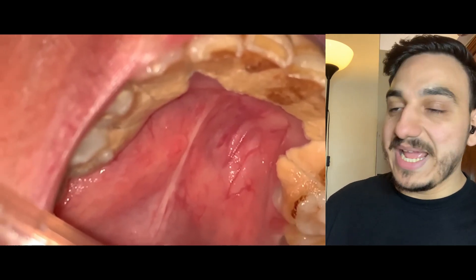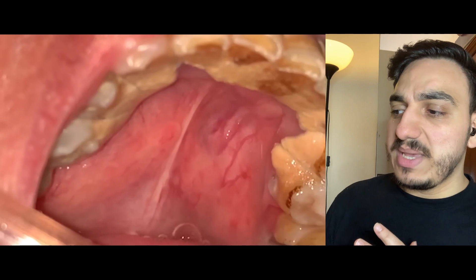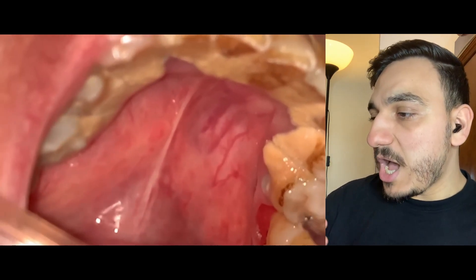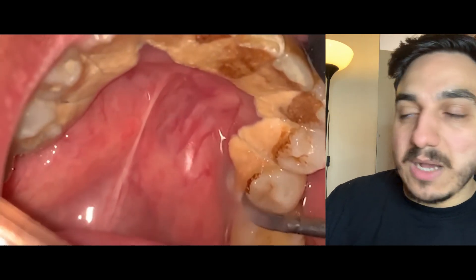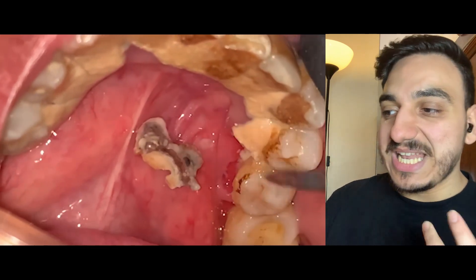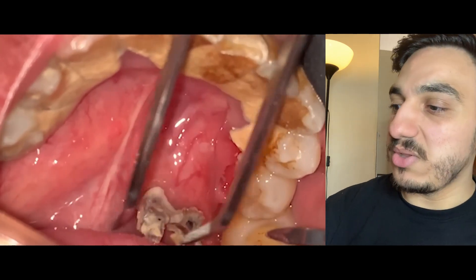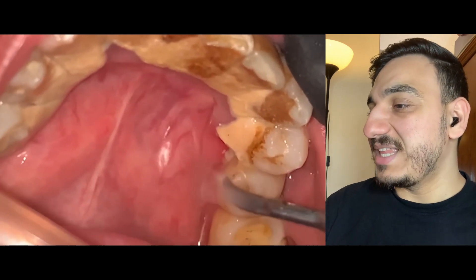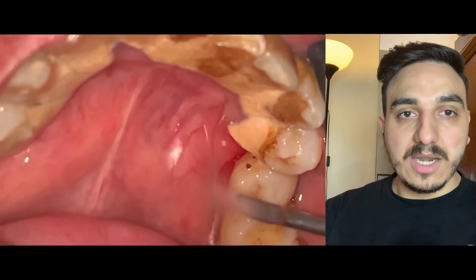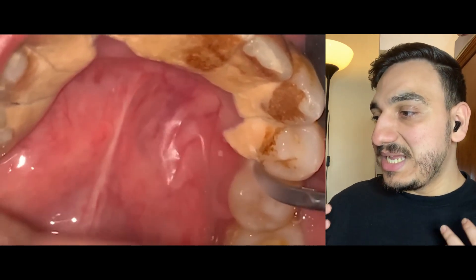The operator is starting in the molar region, cleaning from the inside, trying to go as far back as possible — the last molar or whatever the last tooth is. Look at how the gums are reddish, bleeding, and inflamed underneath. Look at that huge piece of dental tartar and dental calculus! Normally there's suction, but that piece was too huge so a tweezer was used to help remove it. What they're using here is called an ultrasonic scaler, removing all of this dental tartar and dental calculus.